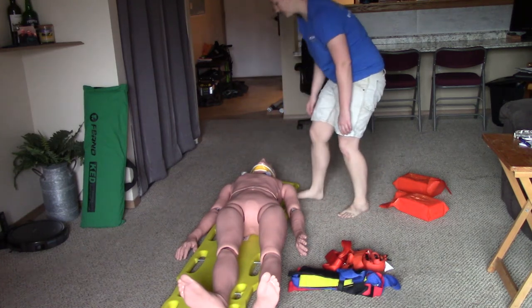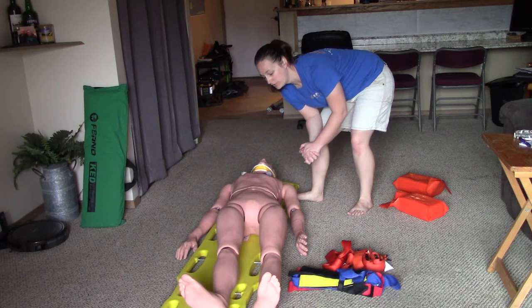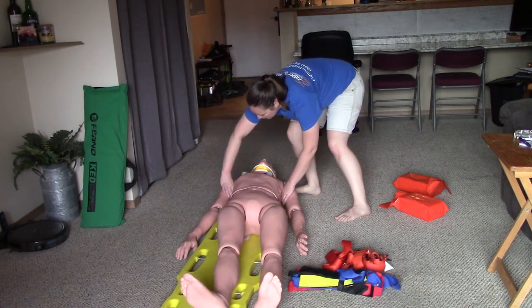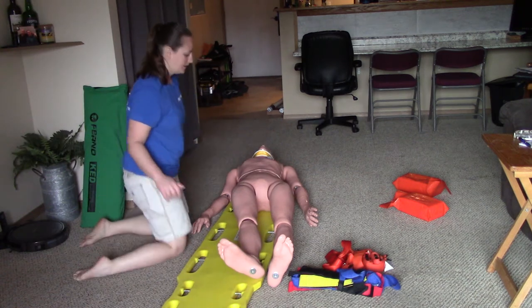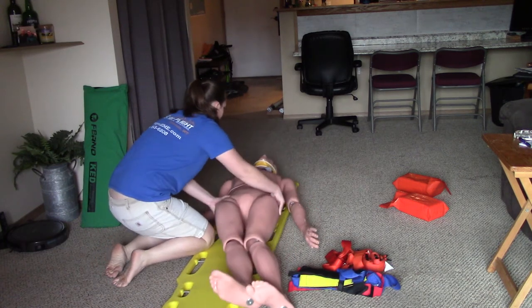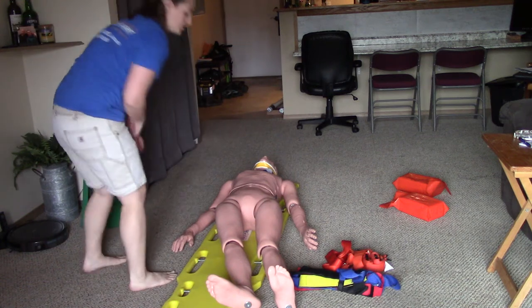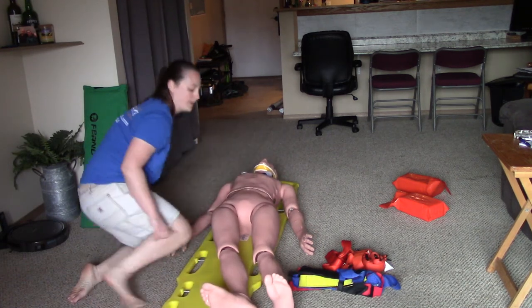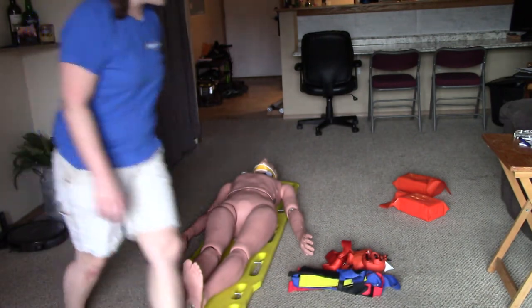You can't just push the patient to the side, as that will misalign the spine. To keep the spine aligned, pull them towards their head or towards their feet — the long axis drag. Typically two people do this: one grabs the shoulders, one grabs the hips. The person on the head makes the calls for direction and distance. I'm going to pull the patient up and slightly to the right about six inches on three, then adjust until they're centered with the head just below the hole at the top of the backboard.